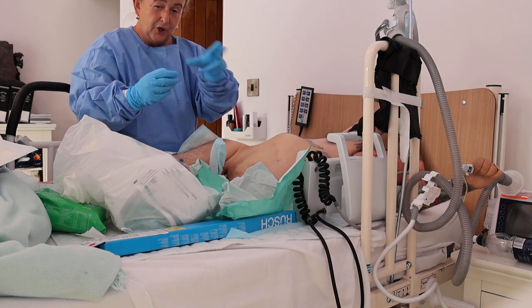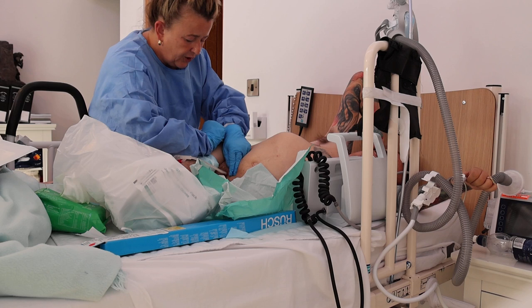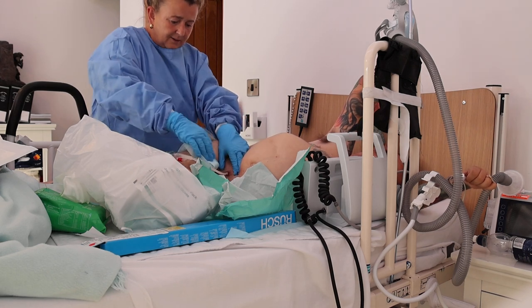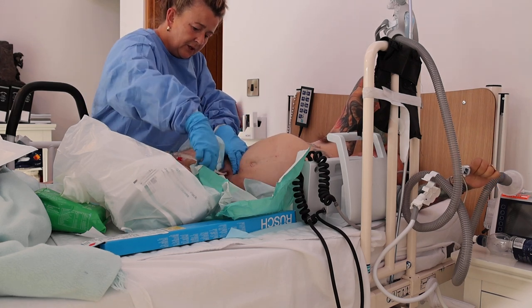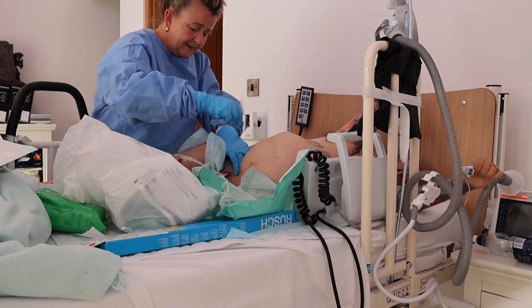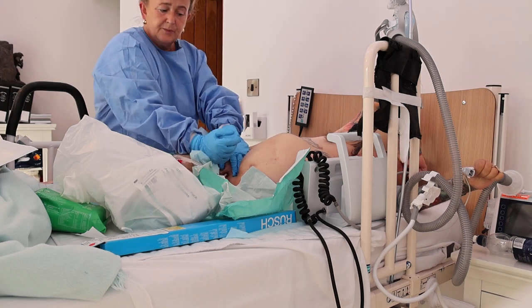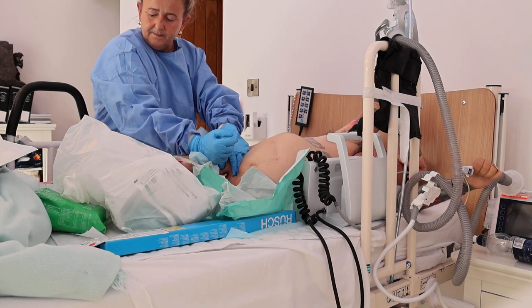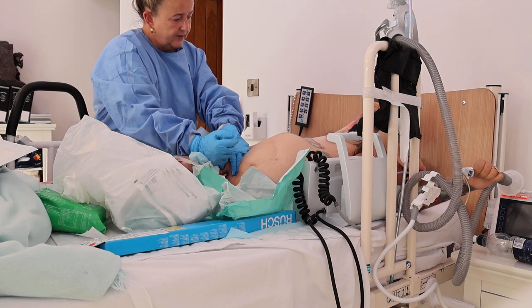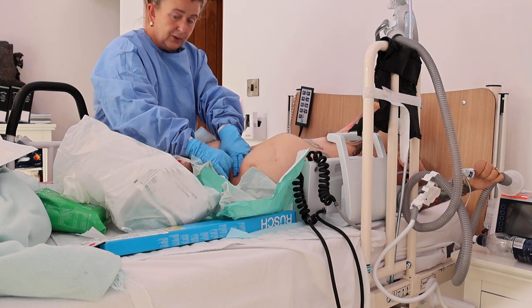This I'm going to use to open up the stoma. So I use my gown. I'll open it up with my fingers. I don't know whether the camera can see that. All this is sterilised, so I can touch any sterilised area. And then, with this, are you ready? I ask you to breathe. One. Nice breath. And then what I'll do is I'll be gently pulling it out.